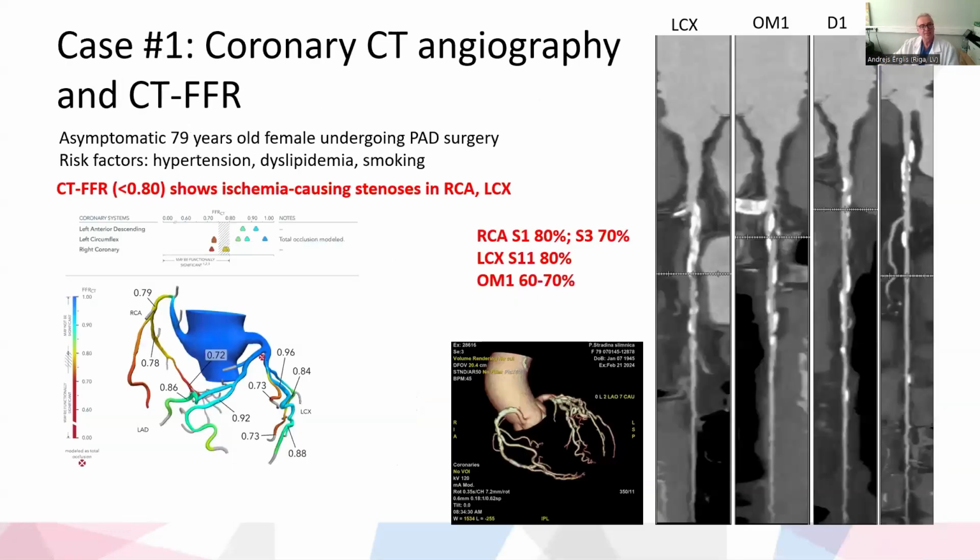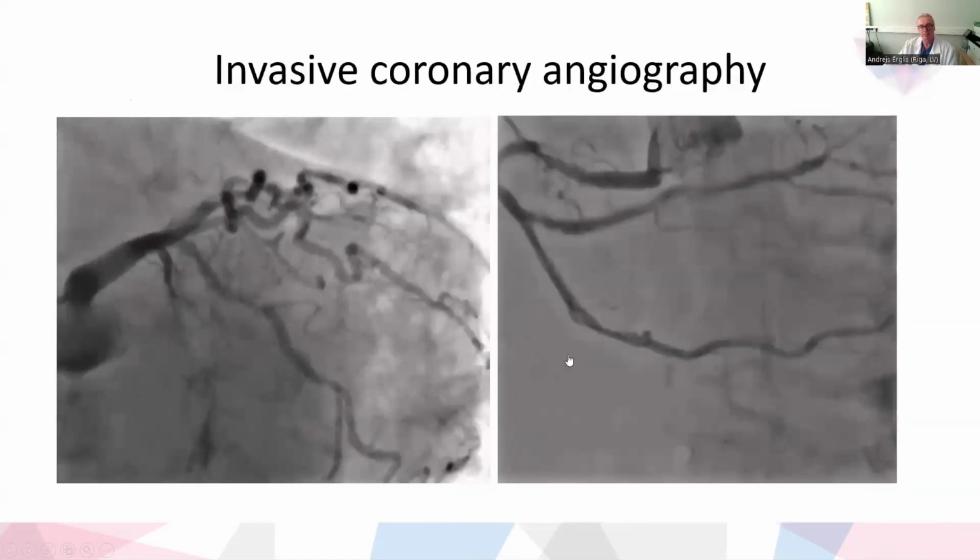and other things. If you go back, this is the same female, and as you see, this is what we started, and actually Riga was who really confirmed this fractional flow result, computational fractional flow reserve. This is the study patient. As you see, we did a CT scan and measured this CT fractional flow reserve, and here you see how calcium looks in coronaries by CT scan.